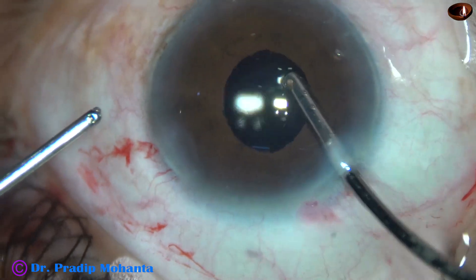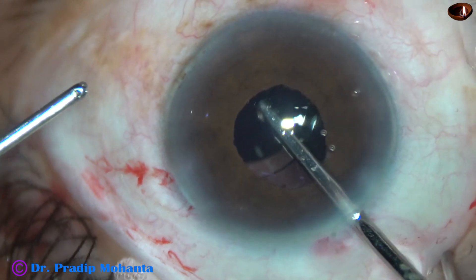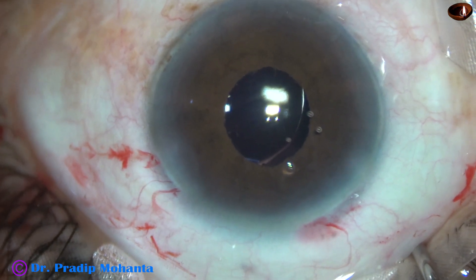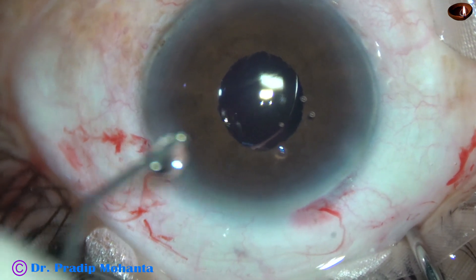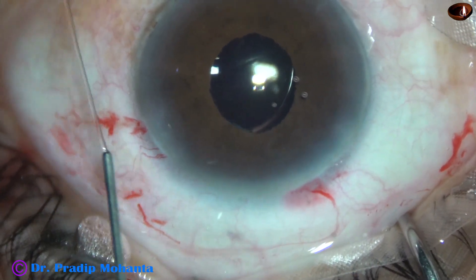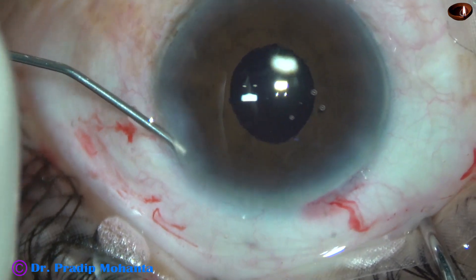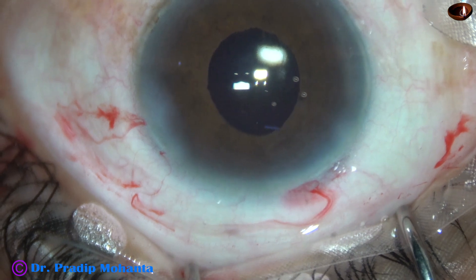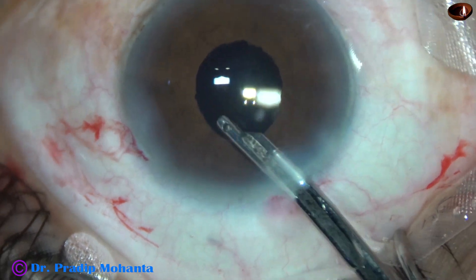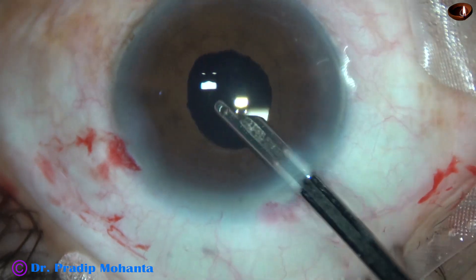Go through with the irrigation first. Go behind the IOL and irrigate the capsular bag nicely. This is moxifloxacin. The side port is closed by hydrating the corneal stroma on either side of this stab wound. This is the final lavage of the anterior chamber.